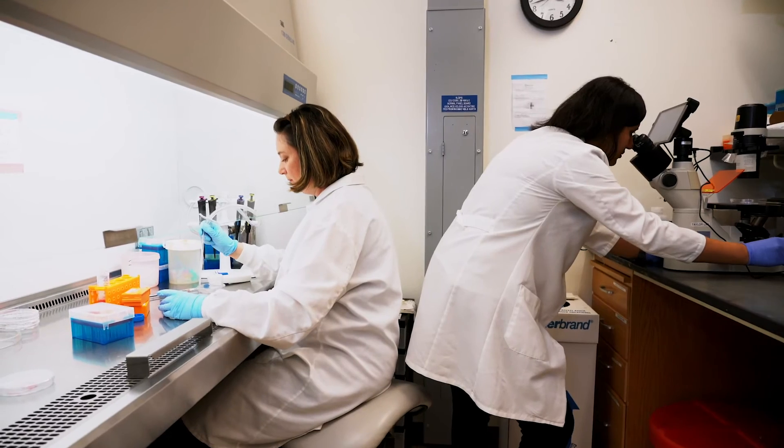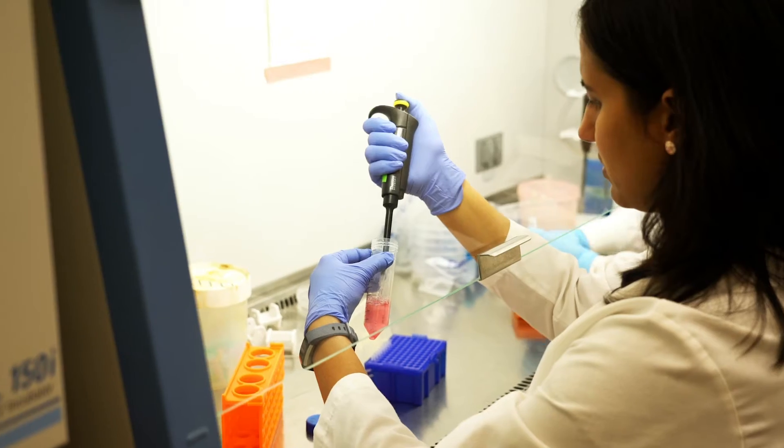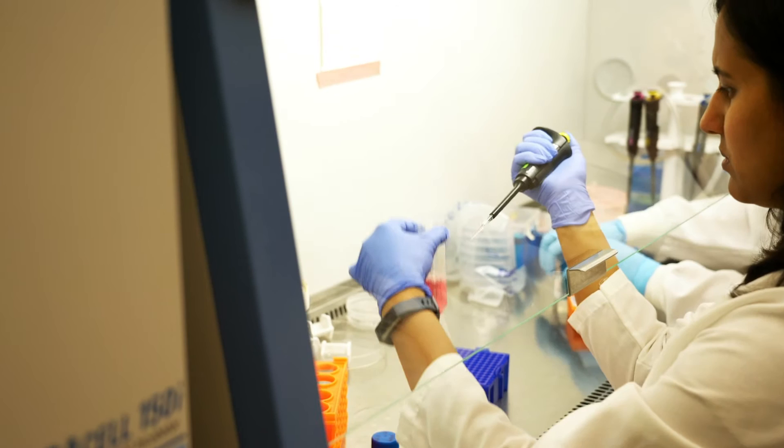I have used these devices to do some axon injury studies, which has been published in one of my recent papers in Nature Communications, where we actually performed axotomy and then looked at how the somatic remodeling happens after the injury.